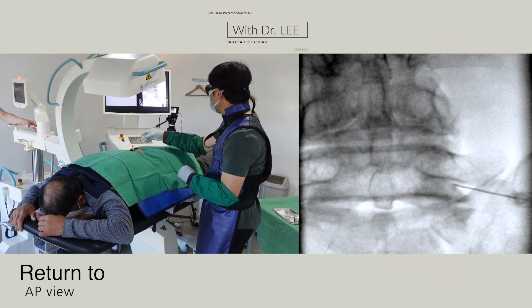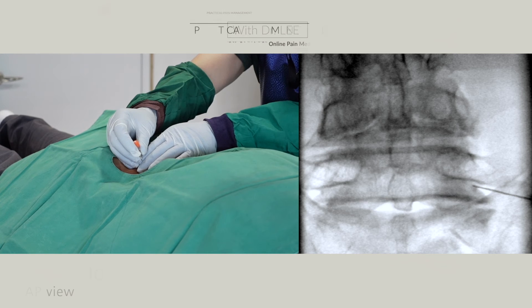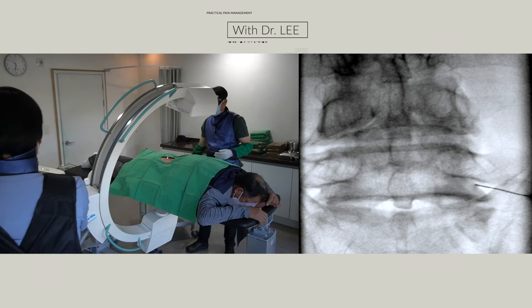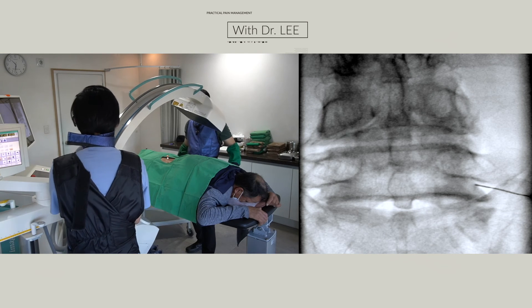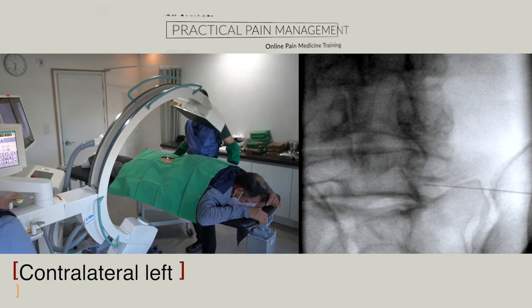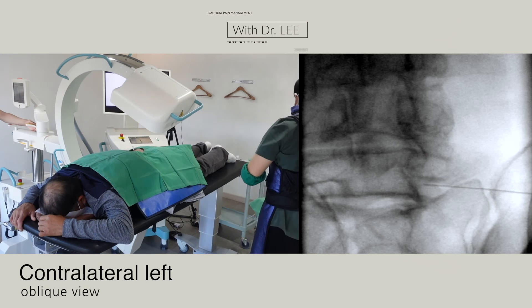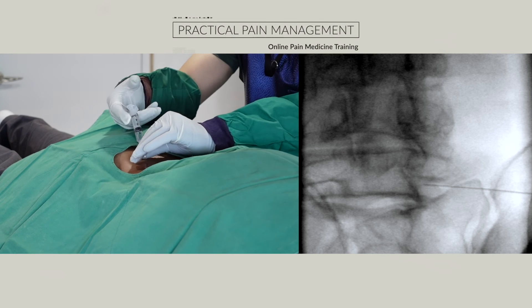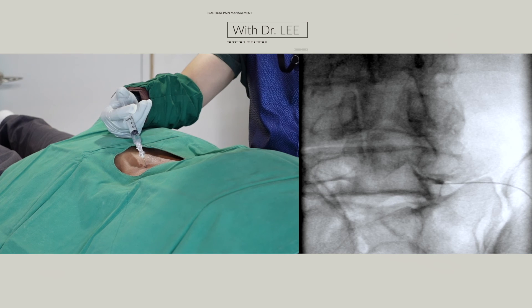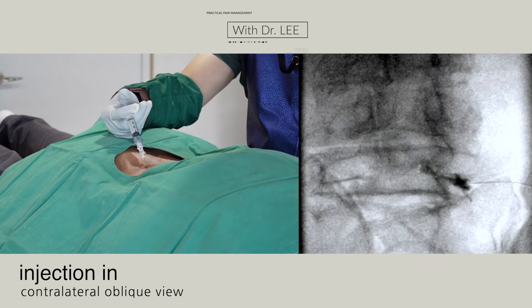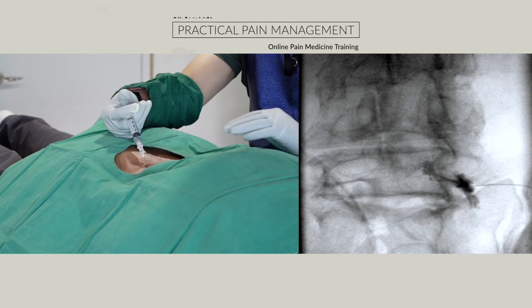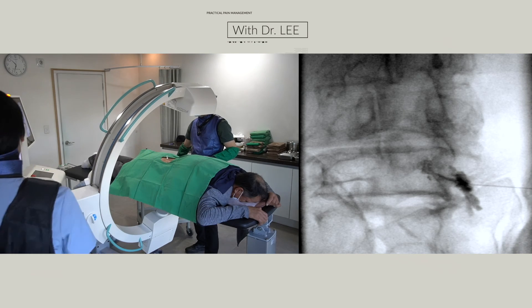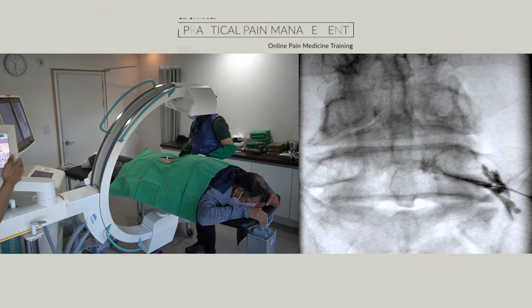Return to AP view. Contrast media injection in contralateral oblique view. Contrast pattern in AP view.